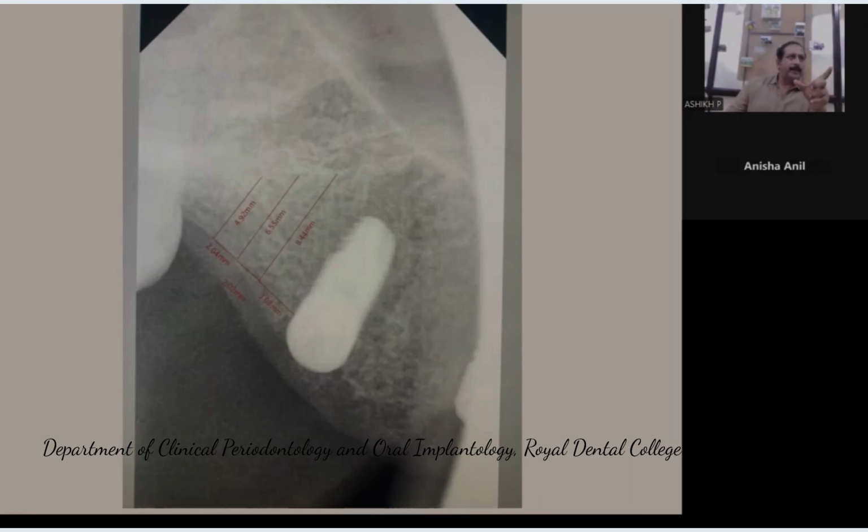Between the 3 from the implant and 2 from the nearby tooth, you could get 4 millimeters. So within that 4 millimeters, you see three different heights of bone here, because your sinus floor seems to be not in a flat base, seems to be a bit more convex, right? So the distal end has got around how many millimeters?